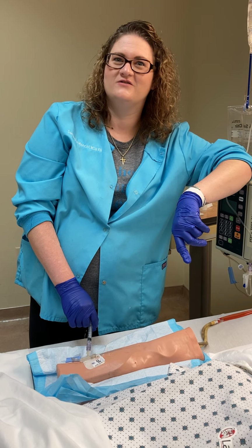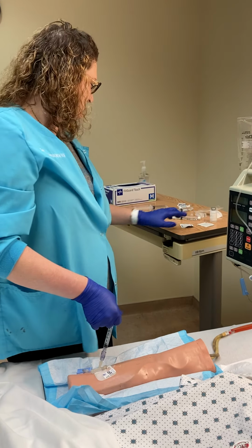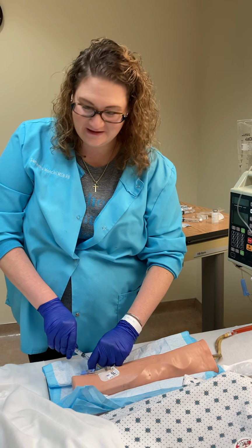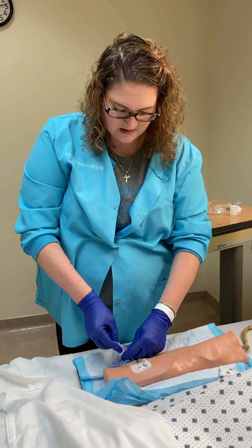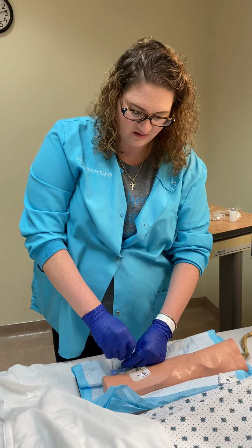I'm sorry, I'm saying 15 seconds. I mean 30 seconds per half ml. Oh my goodness. So after 2 minutes, the full 2 minutes total for all of the Zofran. So 30 seconds per half ml.